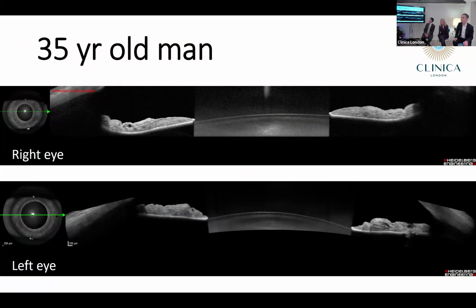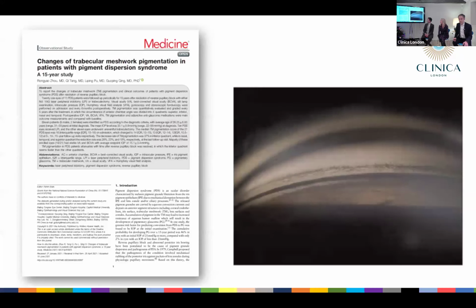Can you see which iris it was, the right or left iris, that I first did the laser iridotomy on? The left, yes. So you can see, well, one, it's not bowing back anymore. It's now flat, and you can actually see the iridotomy there on the right-hand side of it. You can see where the hole's been made. But there you go, you've reversed it now. That patient's not going to be shedding any more pigment. So that's a really nice treatment for pigment dispersion.